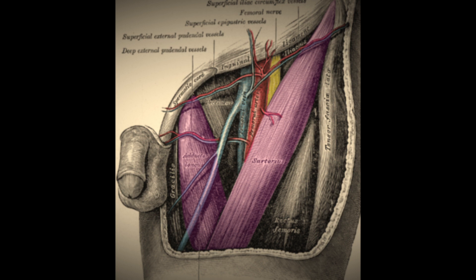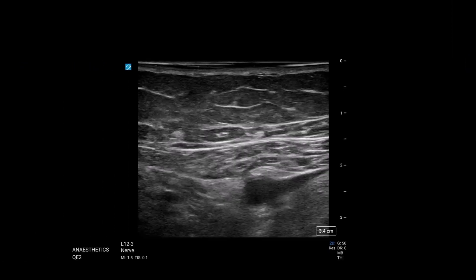So we've got our probe here, and we've got a couple of things we can see already. We've got sartorius here, we've got the superficial femoral artery here, we've got a vein here, we've got some structures here which is what we're interested in. We've got a couple of small structures here which are probably the femoral cutaneous nerves.